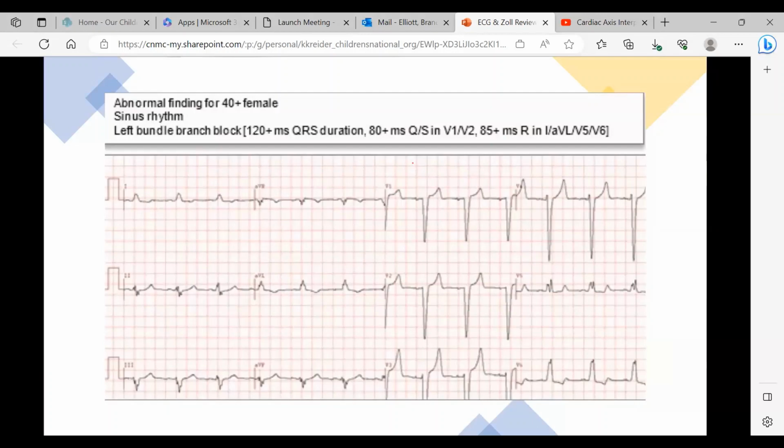It's another example of an ugly EKG because the patient has a bundle branch block. You can't really determine anything in the presence of a bundle branch block until you look at Sgarbossa criteria, which is a whole other day. And guess what? Treating the patient for what they're presenting. So in the 30 seconds we're going across the street, if we think they're having a STEMI, it'd be more obvious in person than on this piece of paper. Some people just have normally ugly EKGs.